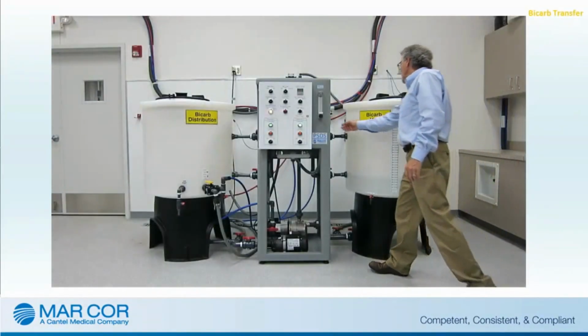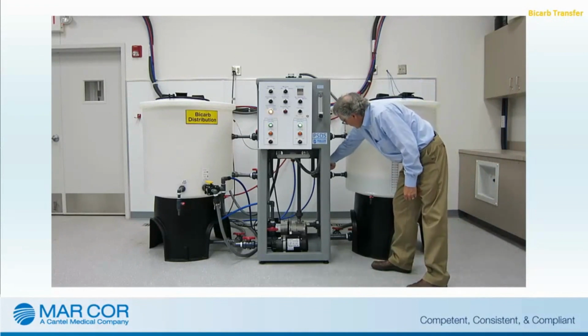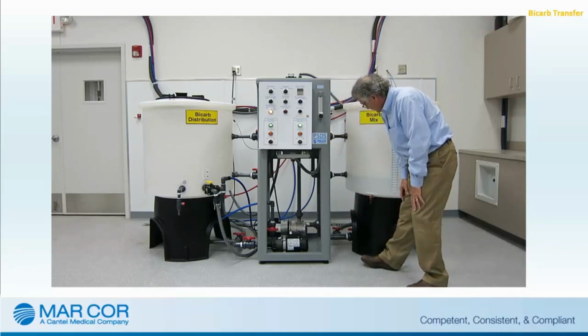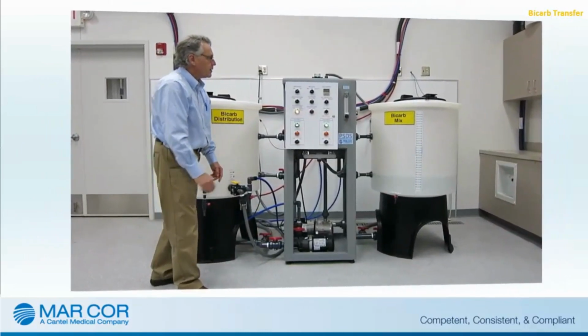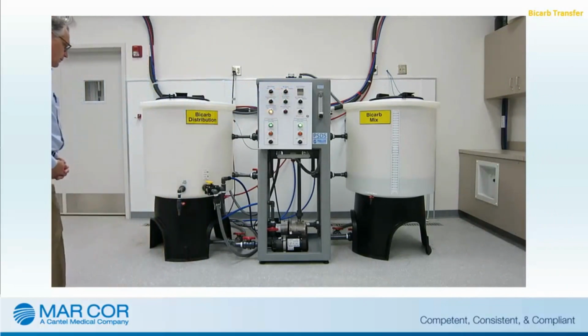Ensure the bicarb solution has been tested and is ready for use. The bicarb solution can be transferred to the distribution tank. To perform the bicarb transfer procedure, the operator will need to ensure that the valves are in the correct positions and the mix pump turned to the transfer position.